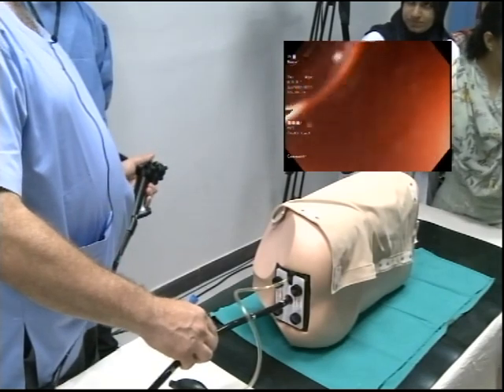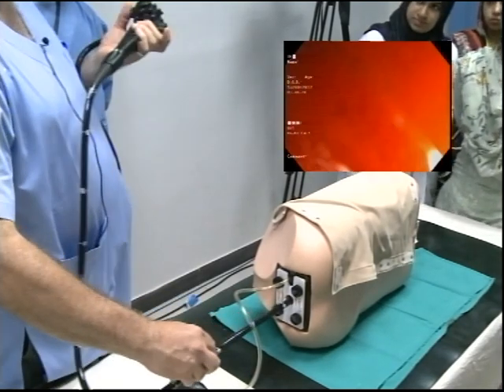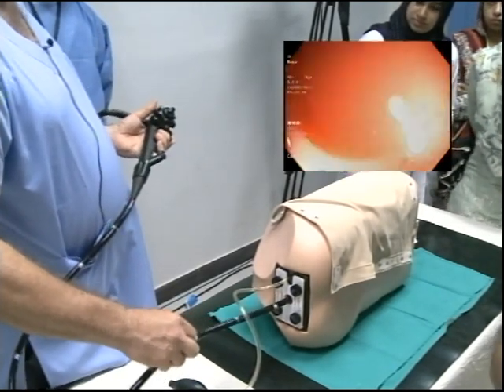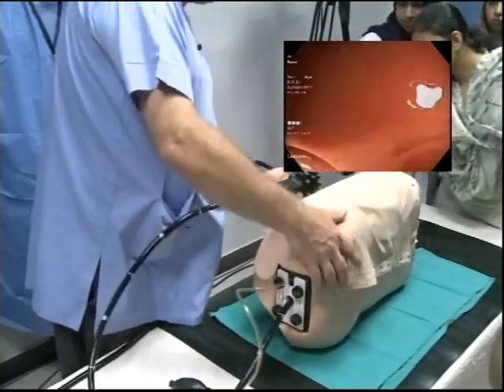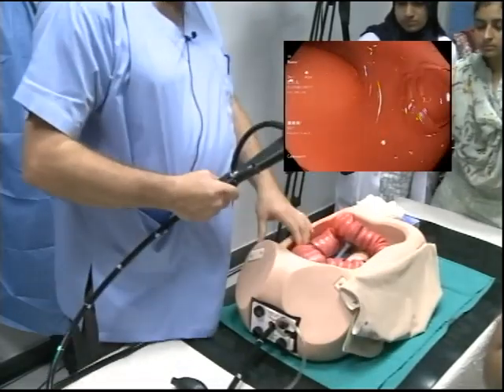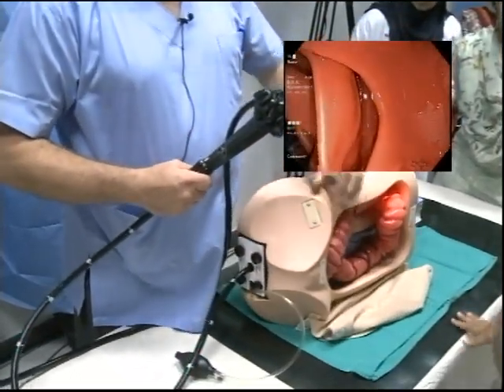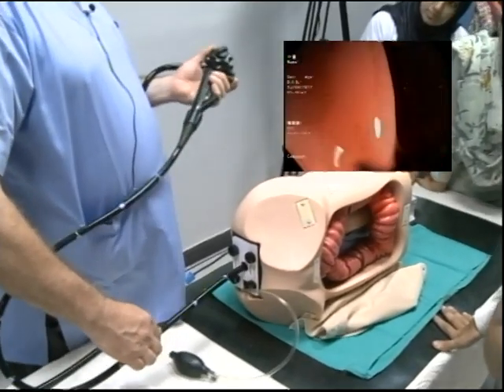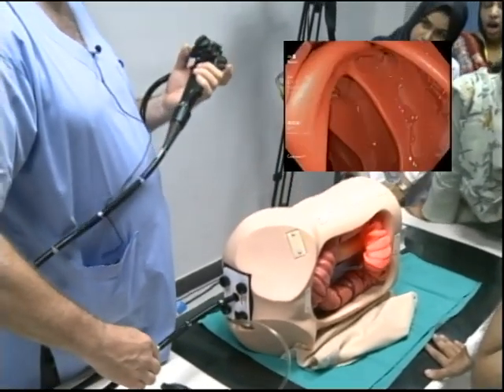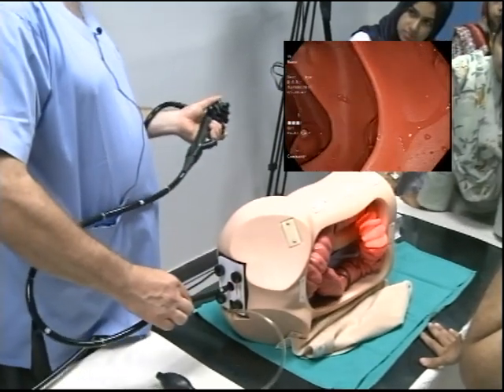Right, so can you see what we're doing? Now we should be roughly at the hepatic flexure. If we draw back a little bit more, you'll see it come into view. As a result of that, let's put the patient back onto the back. And then to open up the hepatic, we put the patient back into the left lateral as it comes round. So can you see the boldness of actually moving patients around? Yeah?